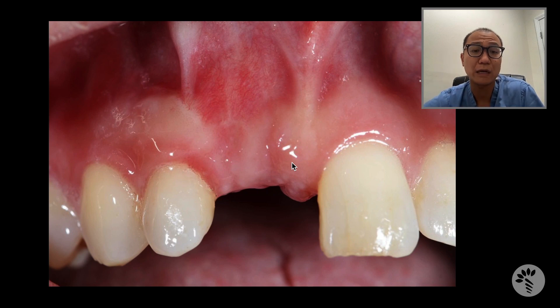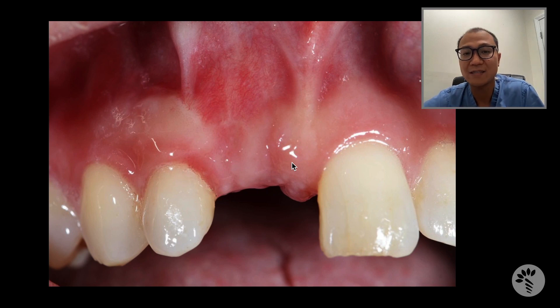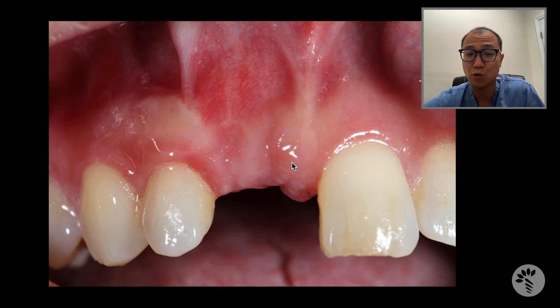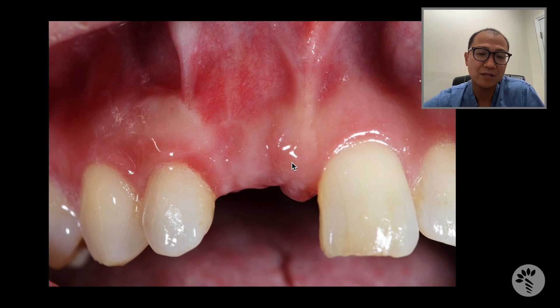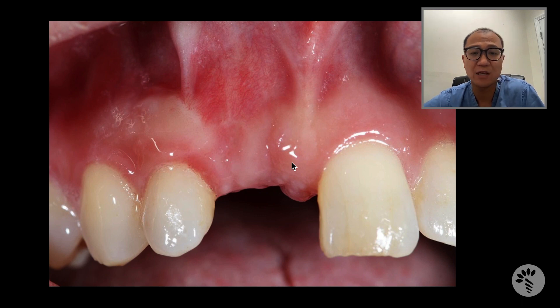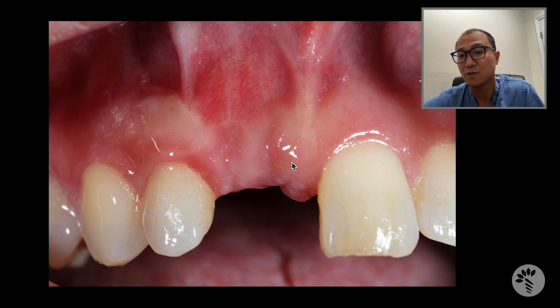Caitlin unfortunately lost her maxillary right central incisor due to resorption, making the tooth unrestorable. Nine months ago, I did an extraction and large bone augmentation on this area, and the site appeared to be ready for a dental implant.